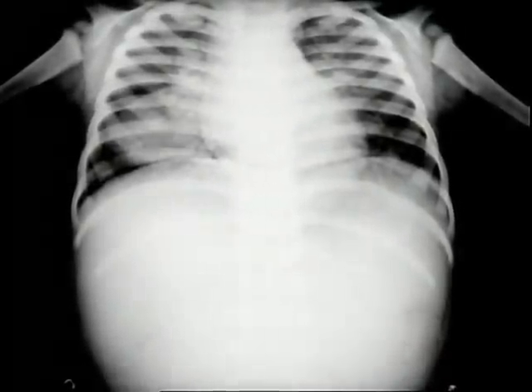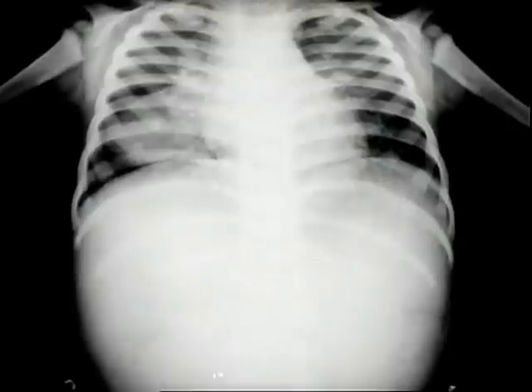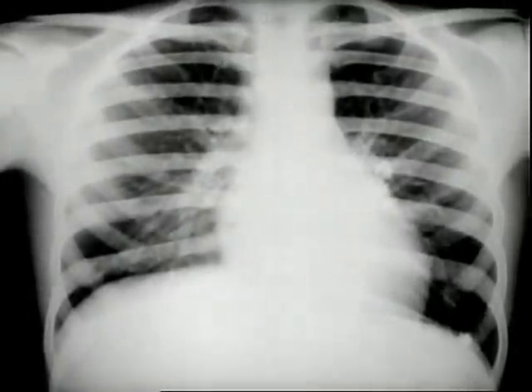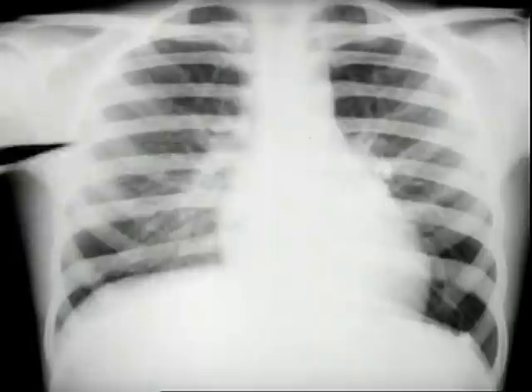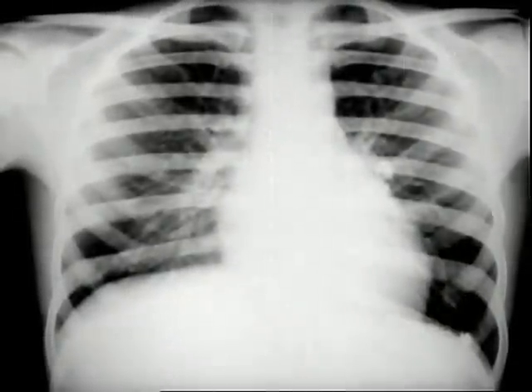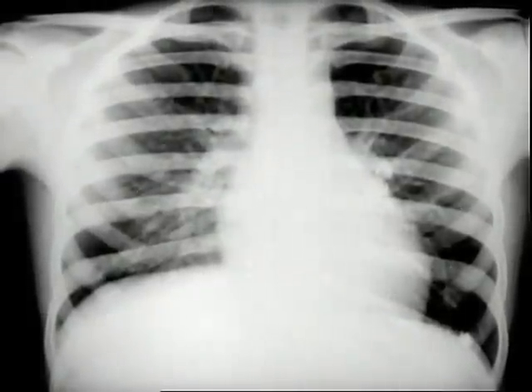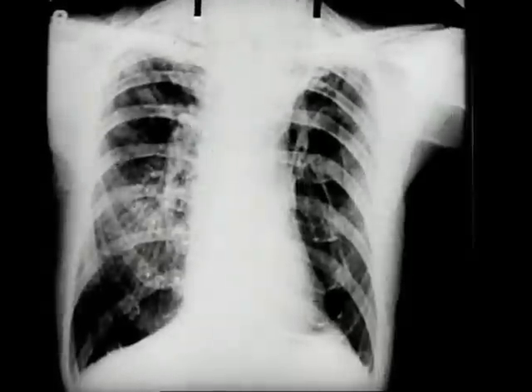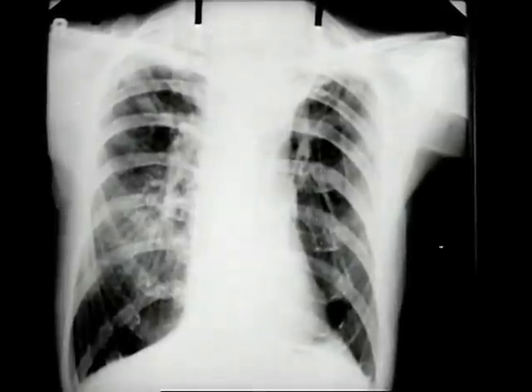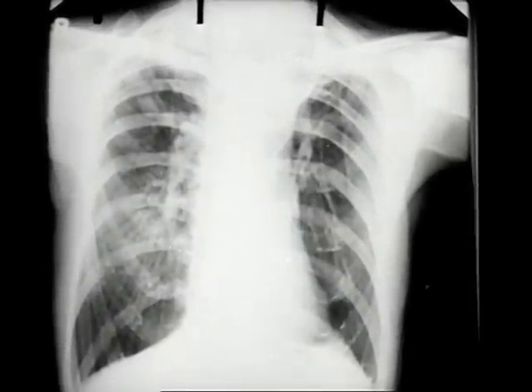To illustrate first infection forms of tuberculosis, we have here a primary bronchopneumonia in a child of six months that was nursed by a maid who flatly denied any subjective symptoms, but who showed extensive pulmonary disease by X-ray. This film of another primary complex shows the pulmonary component, the Ghon focus, and the lymph glandular hilar shadow in a child of three years. The tuberculin test taken in a routine survey was found positive, and checkup by the family physician revealed as a household contact a grandparent with evidence of advanced tuberculosis — treated for so-called asthma and chronic bronchitis for many years — whose sputum subsequently showed tubercle bacilli.